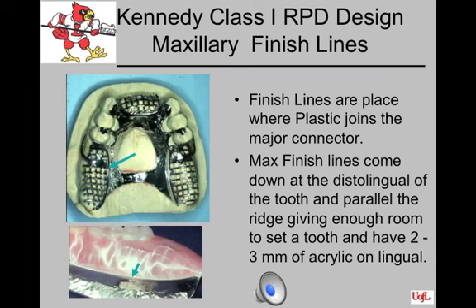The finish line goes back almost to the hamular notch area, but it allows enough room so that the coverage through the hamular notch is that of acrylic, so as to make adjustment easier in that area.